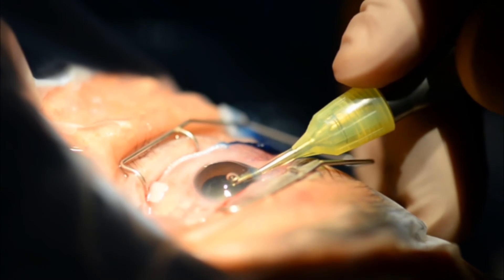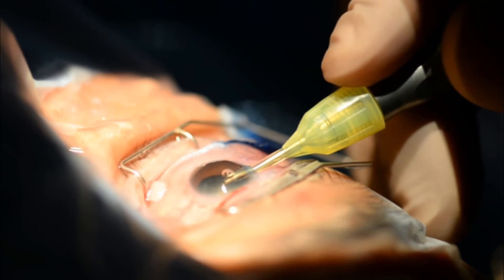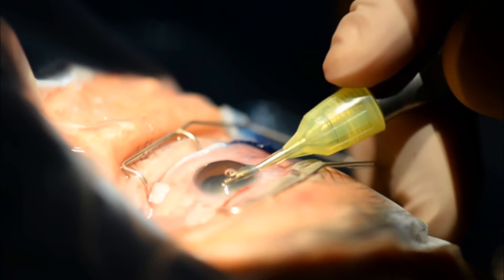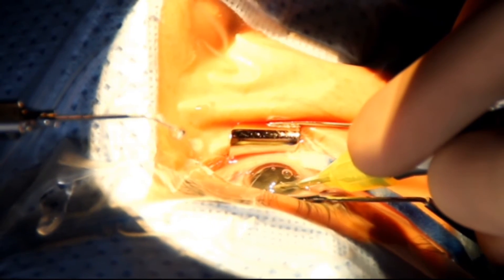While grooving, it is very important to keep in mind that the ultrasound power of your probe is doing most of the job. Therefore, try to limit the amount of mechanical force that you are exerting on the eye. Don't press sideways on the globe as you are proceeding with your stroke, and do not press down on the lens, as these maneuvers will stress the lens zonules.